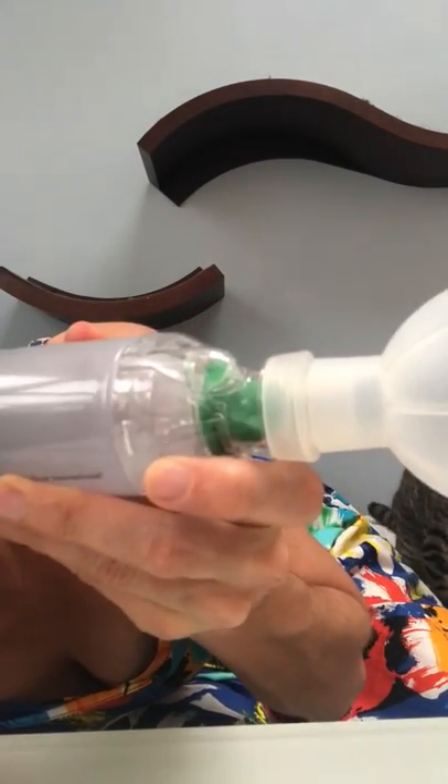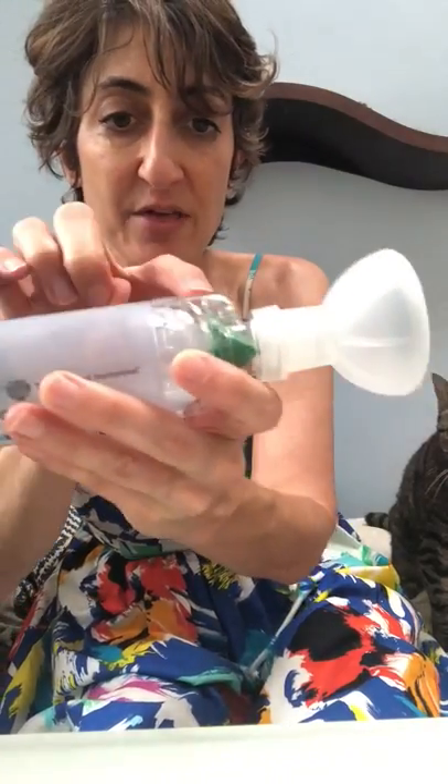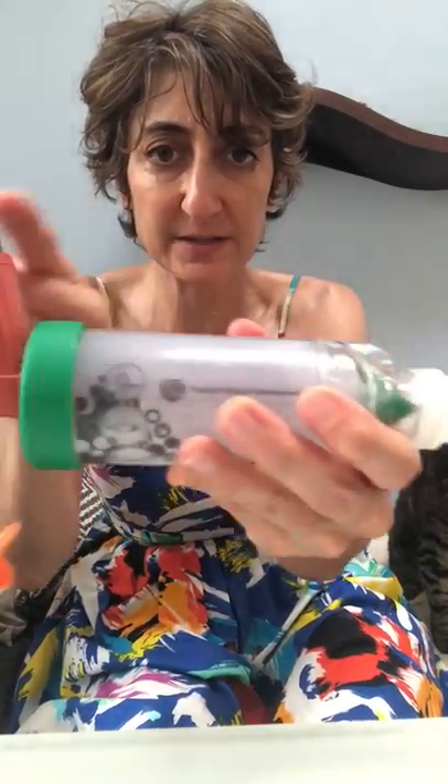I'm just going to breathe into it so you can see. See how it moves? So every time your cat takes a breath, that little paper is going to move. When you put this on, you want to be sure that you can see the paper, so I usually have it in the same place — if that makes sense.